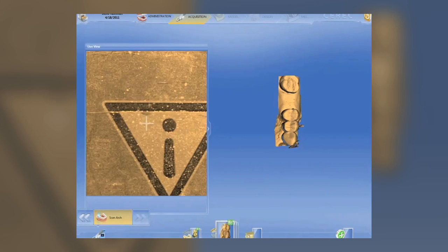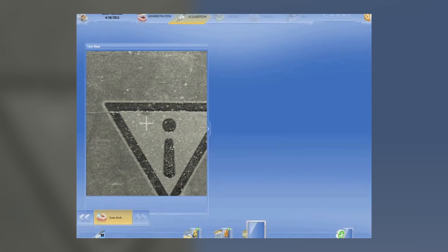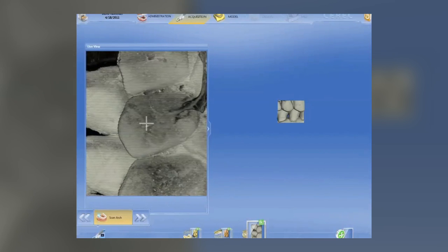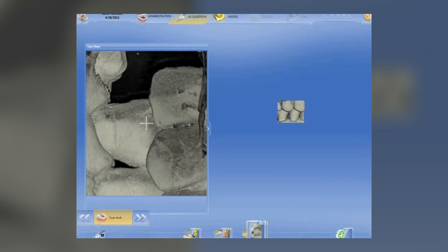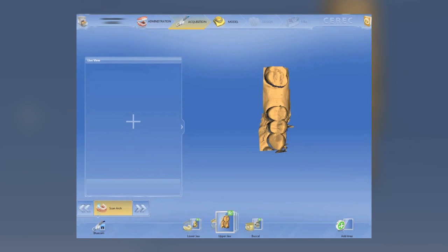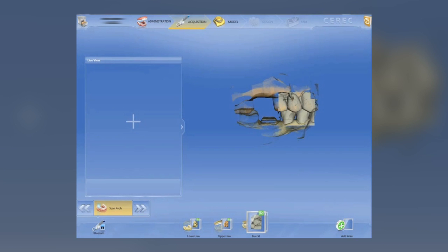We take the preparation picture, the opposing picture — actually, there is no more preparation and opposing. There's upper jaw and lower jaw images, simply because we have the ability to go ahead and take and design restorations on opposing arches at the same time. This is not something that the old software could do. So we take our upper jaw, lower jaw images, and our buccal bite images. The concept is the same as before, except the process and visualization are a little bit different.